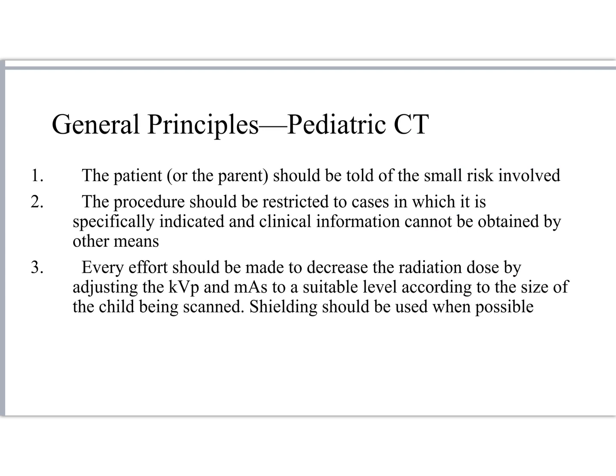All right, with pediatrics, of course, the rules completely change and everything flies off the rails, right? It's going to be helpful to explain to both the parents and the child that there's a small risk involved, right? And the risk is related to exposing them to radiation. You can compare it to being out in the sun for too long and getting a sunburn. You're going to do everything you can, and they're not going to receive a sunburn today because you're going to do everything you can to protect them and keep them safe, right?